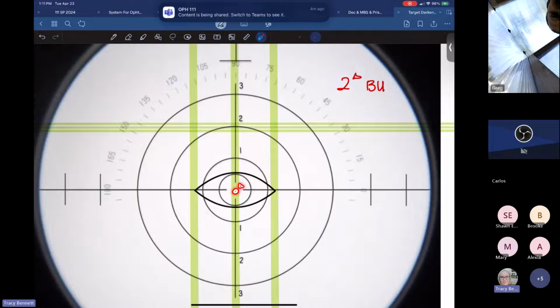This is the 0 diopter prism point. And you think about the eye. Oh, one thing I left out that I shouldn't have is that this point right here, wherever the center of this target goes, this line, you can think of this as the base of the prism. That's the big key. Where this central crossing line is the base of the prism. And so you can see that if the eye is here and the base of the prism is up here, then we are displaying base up prism. That's where Greg got the base up.